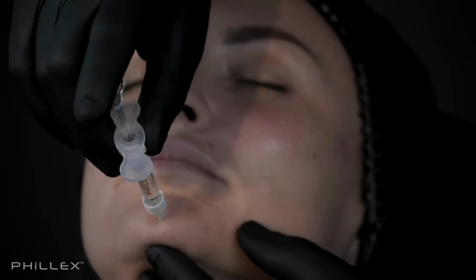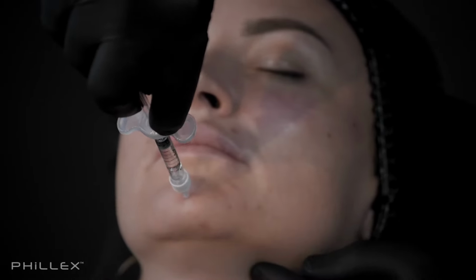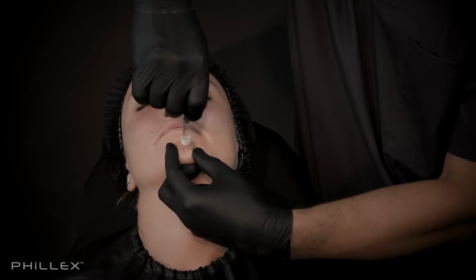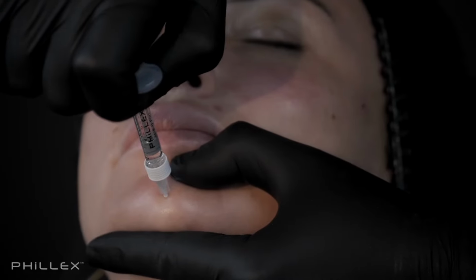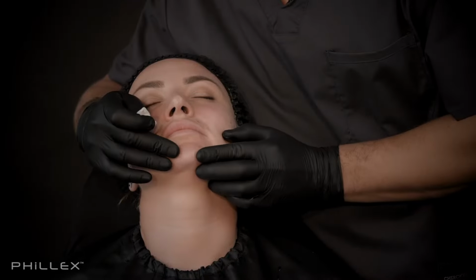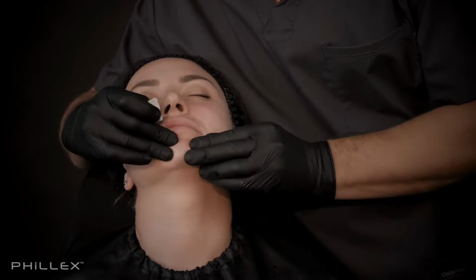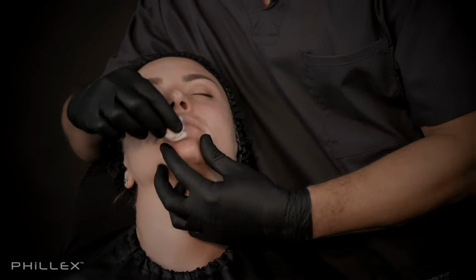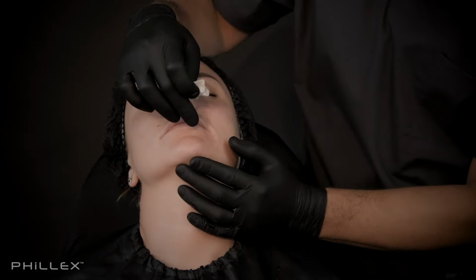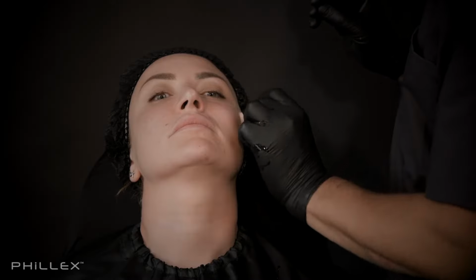One more aspiration probe. We are fixing the surrounding tissue with the fingers and injecting 0.7 cc into the chin. And once more, we are making light massage to create that form that we need. And what we need is to elongate and to make a little bit more pronounced chin.